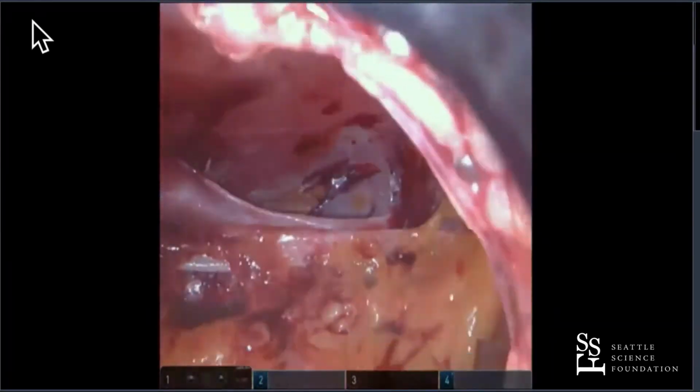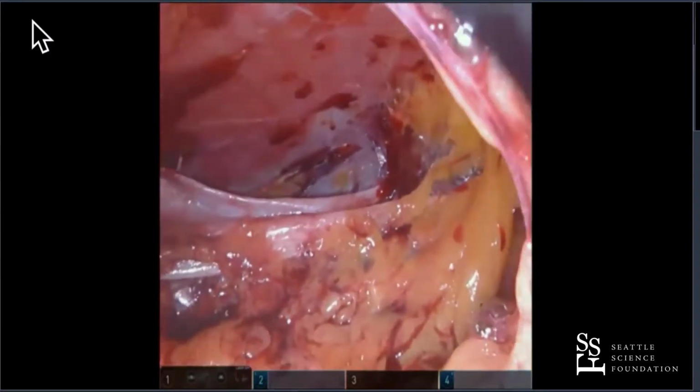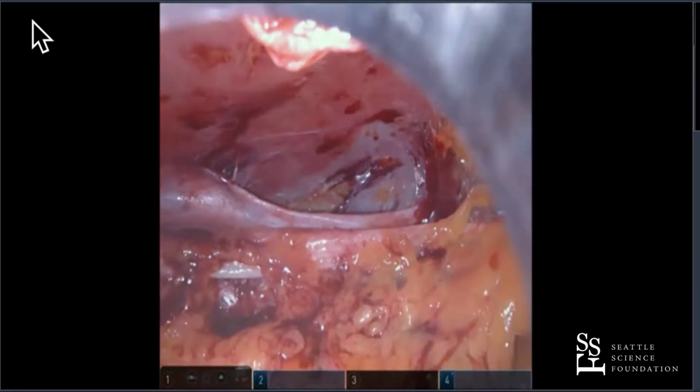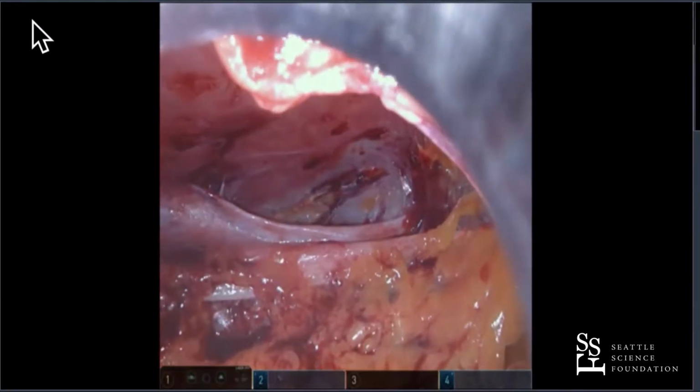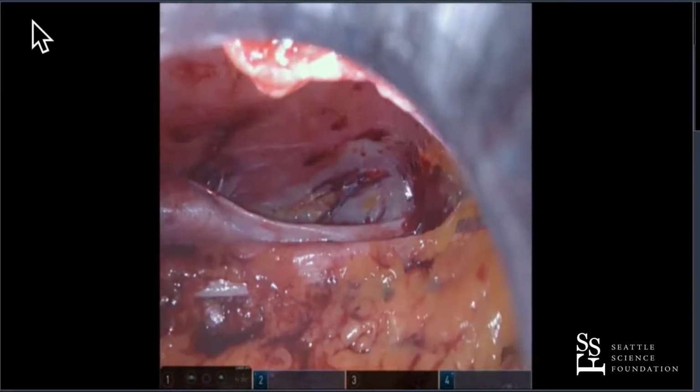Now our assistant. Do you guys have any questions? Yeah, there was a question. Actually, John had a question earlier. He said, is there any limit to how much you can pump up that balloon? You said in your lecture you do like 50, 60 pumps, but is there any limit? I've never had a balloon break. I guess that would be the limit, but I've never had one of those break.